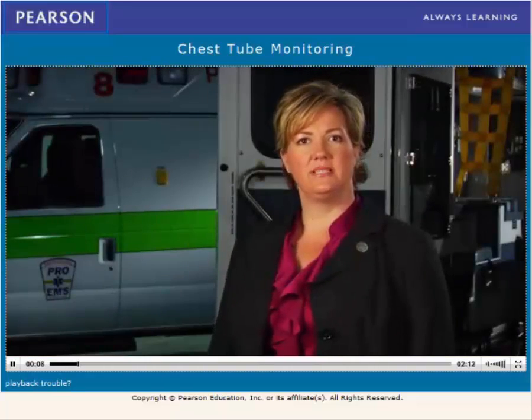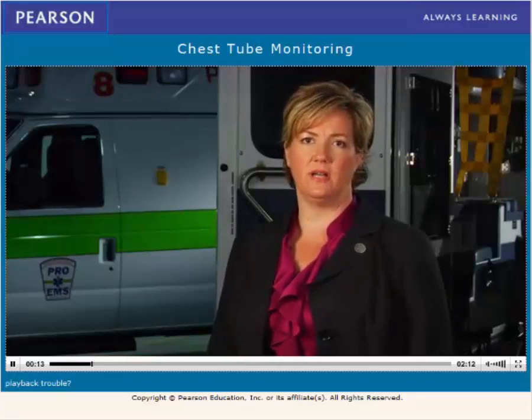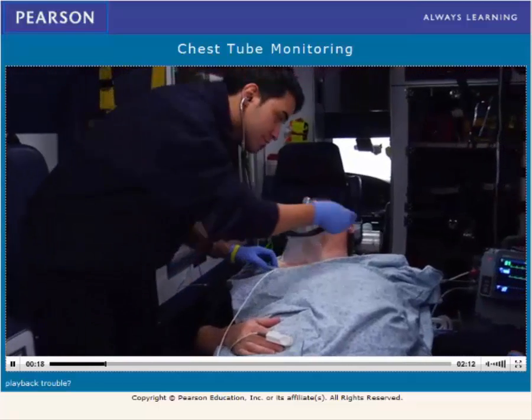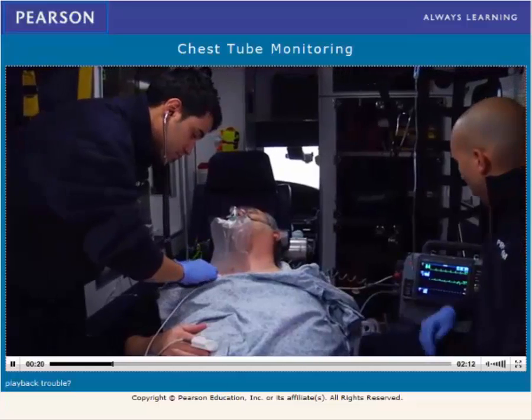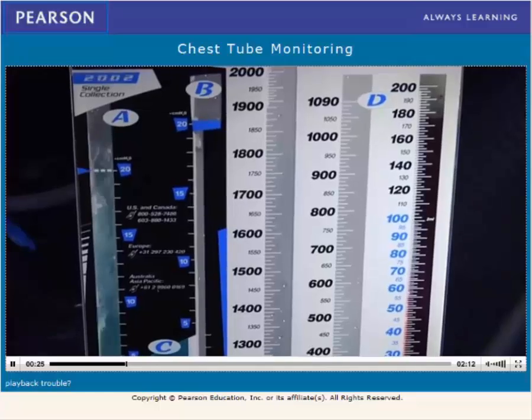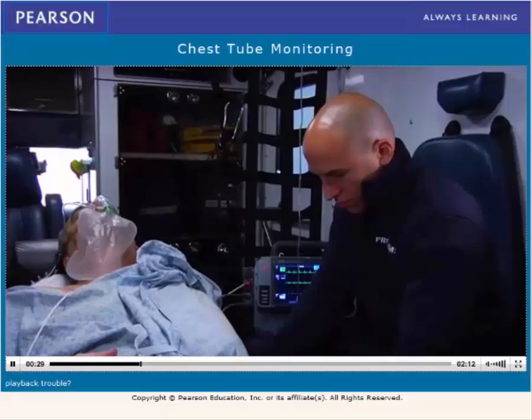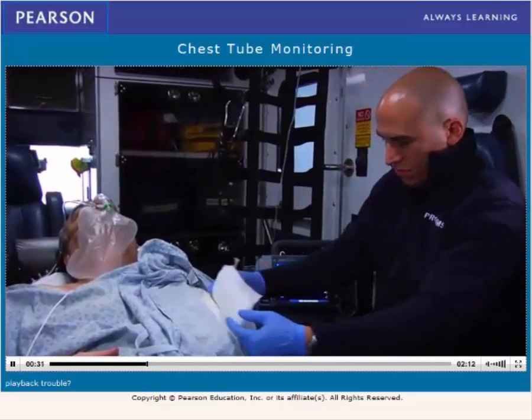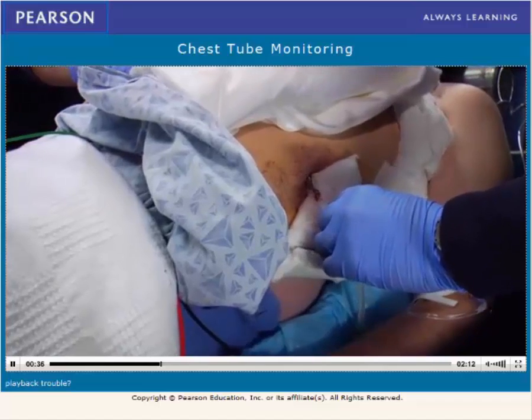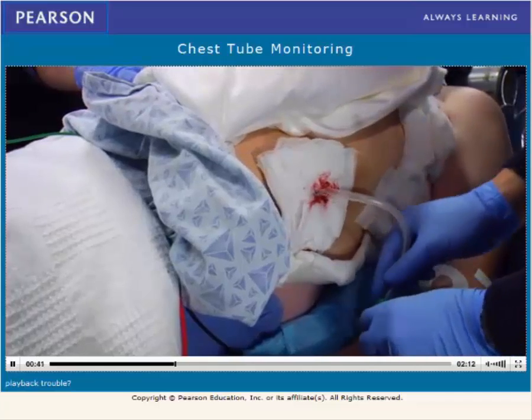A chest tube is placed in a patient to restore the intrapleural pressure and allow re-expansion of the lung after a pneumothorax or hemothorax. While paramedics do not usually place chest tubes, they do transport patients with chest tubes in place and therefore will have to monitor the pleurovac system and troubleshoot problems. Assess the chest tube insertion site to ensure the tubing is still sutured in place securely and that the suture site is not infected. Document the insertion site and condition of skin, including absence of subcutaneous emphysema at the site.